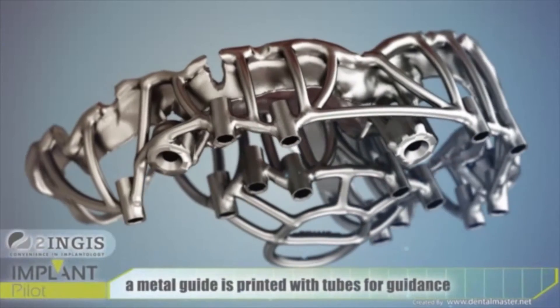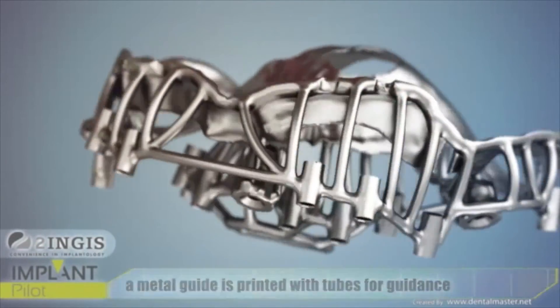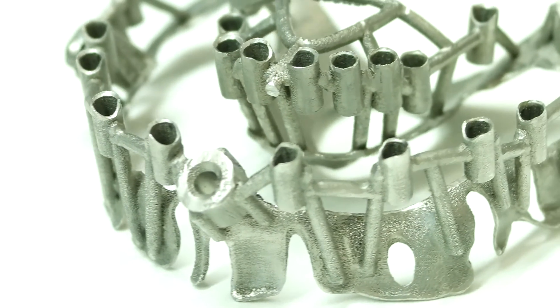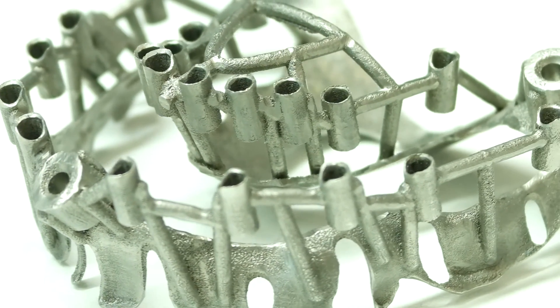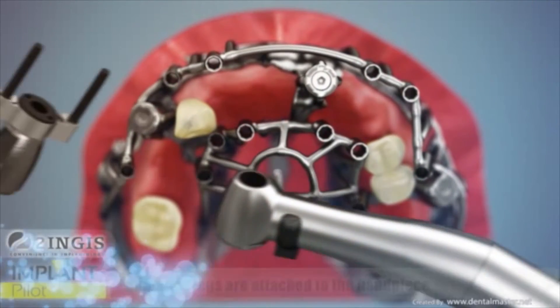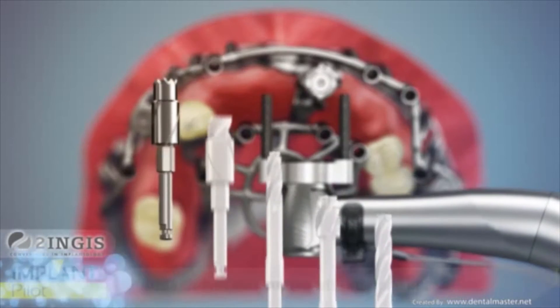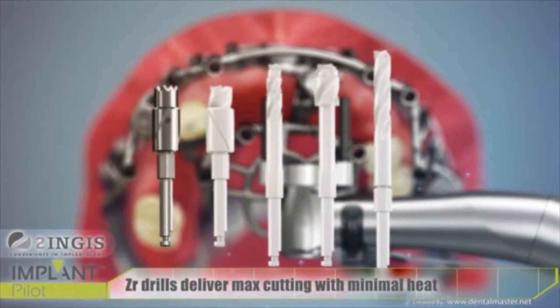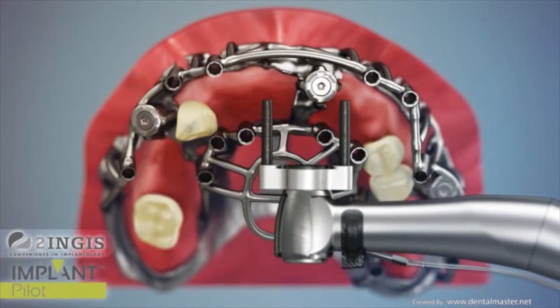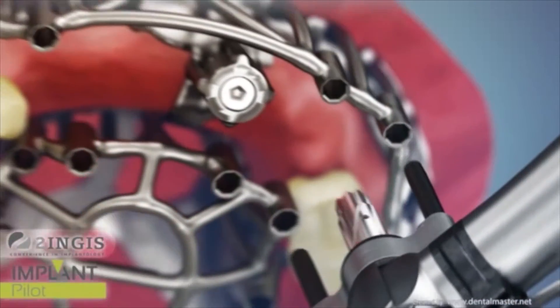When this is done and the doctor agrees on the position, we produce the surgical guides by laser melting or resin 3D printing. The surgical guide is finished and the dentist receives from us the guide and a surgical plan — meaning all the instruments and all the surgical steps needed to place the implants in the mouth, and immediately place the final abutments and temporary restoration on top.